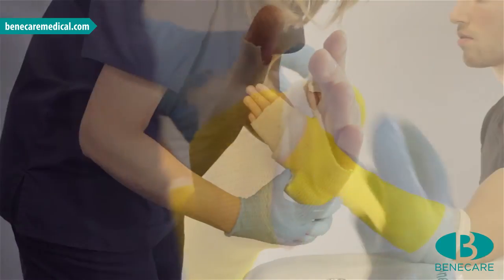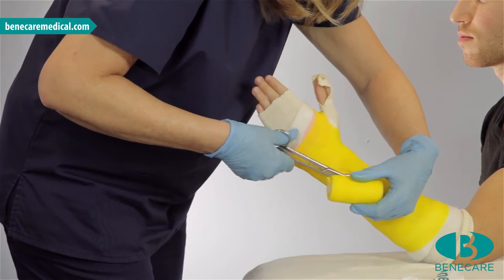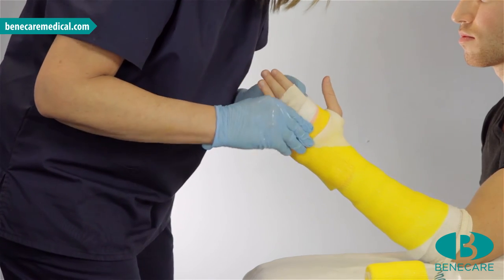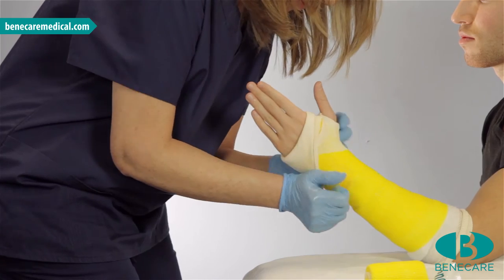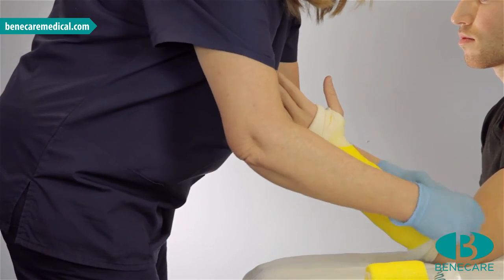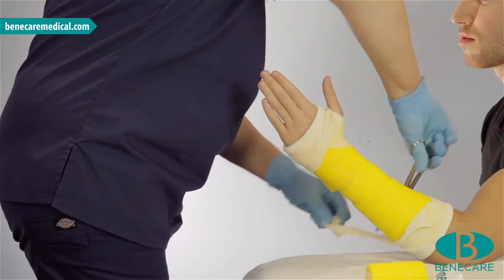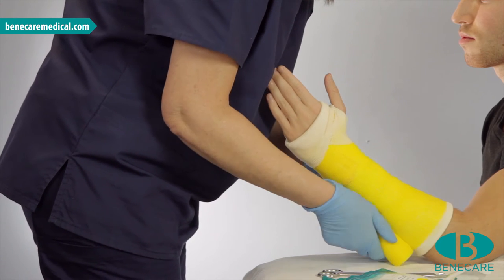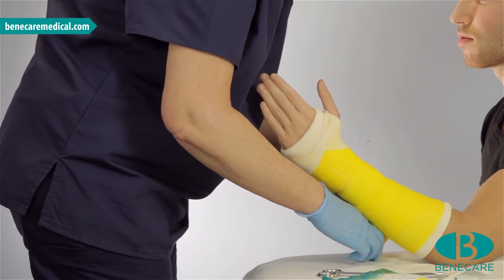Bring the bandage around the wrist to capture the ends and cut off. Turn back the stockinette at each extremity and trim if necessary. The stockinette should not be more than 2.5cm, as this will affect the lamination of the cast and will clog the blade during the removal process. Using the remainder of the bandage, start to wrap around the arm at the proximal aspect, as with the first application.